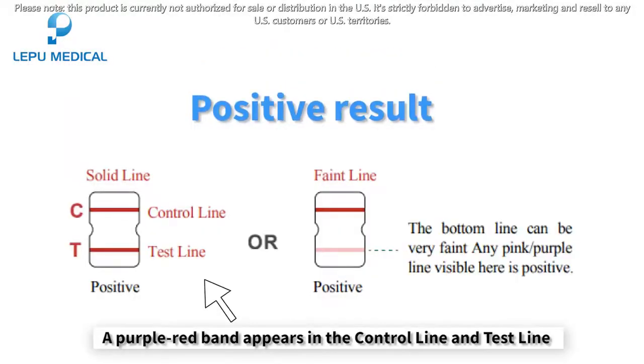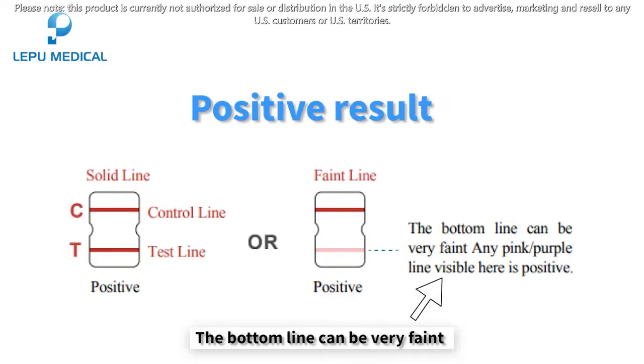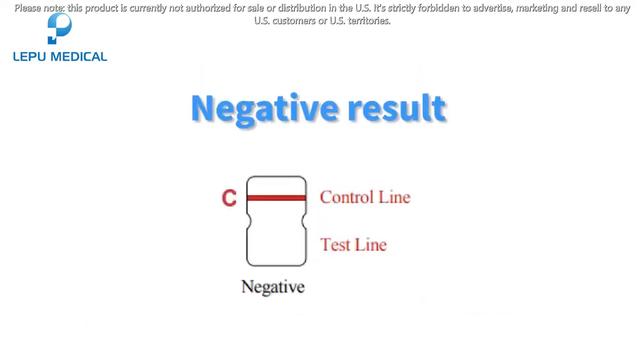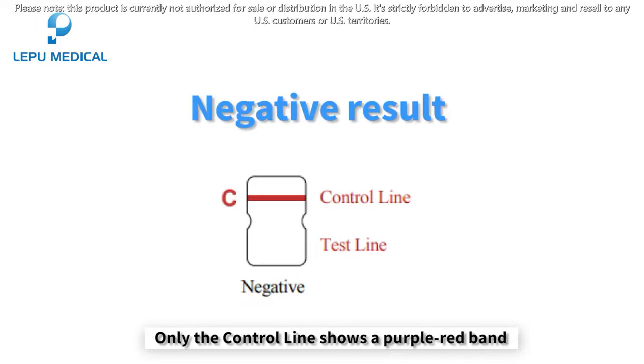Positive result. A purple-red band appears in the control line and test line. The bottom line can be very faint. Any pink-purple line visible also indicates a positive result. Negative result. Only the control line shows a purple-red band. No purple-red band appears on the test line.